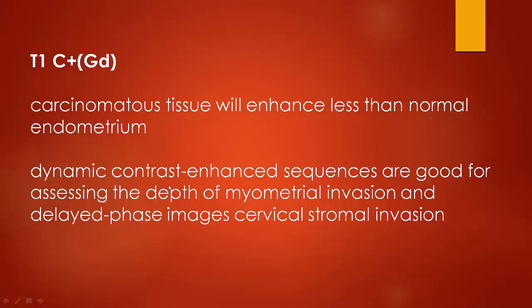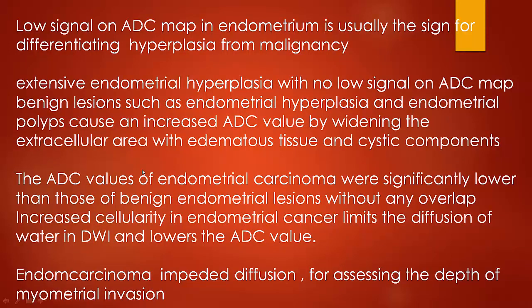Dynamic contrast enhanced sequences are good for assessing the depth of myometrial invasion, and the delayed phase images for cervical stroma invasion. Low signal on ADC map in endometrium is usually a sign for differentiating hyperplasia from malignancy.